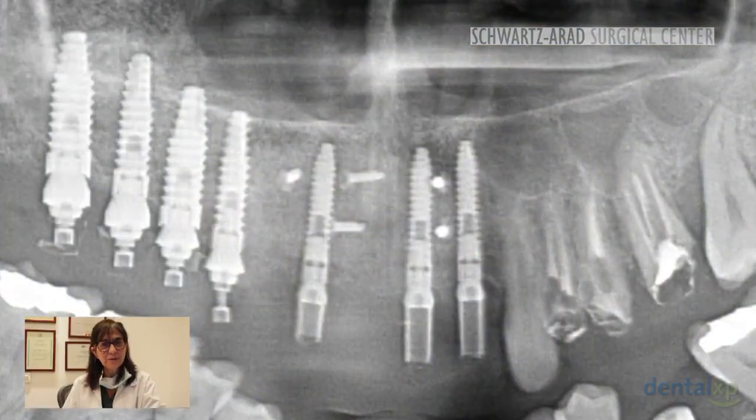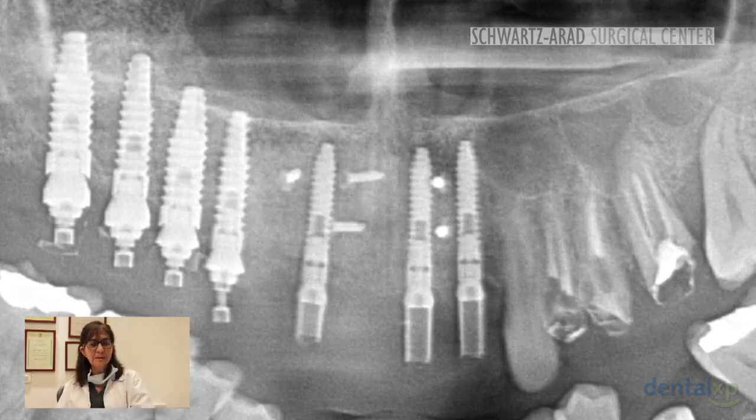One can see here in the postoperative panoramic view the few fixing screws at the anterior maxillary area in between the 3 millimeter diameter tapered BioHorizons implants, and on the right side the sinus lift procedure and the four implants placed there together with the temporary multi-unit abutments supporting the temporary bridge.